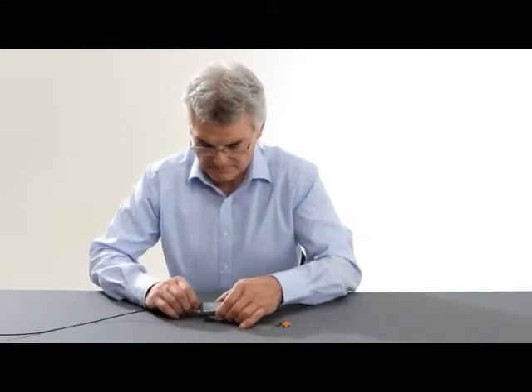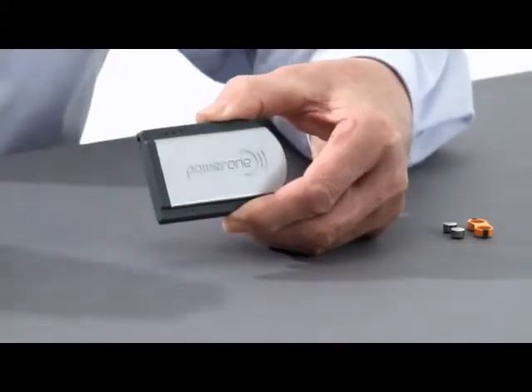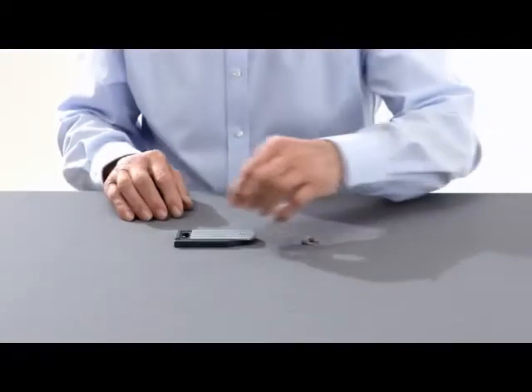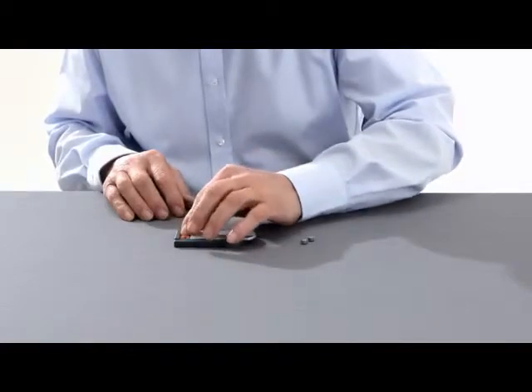You can now remove the cable, so you don't need to rely on a power outlet, even on the move. You can now insert one or two Power One rechargeable batteries.